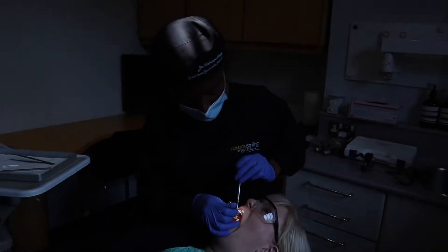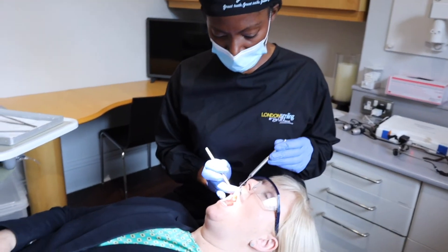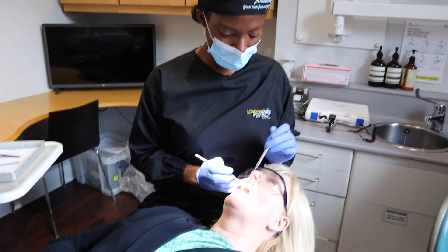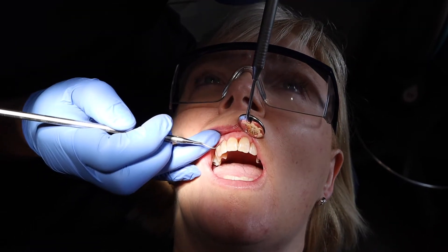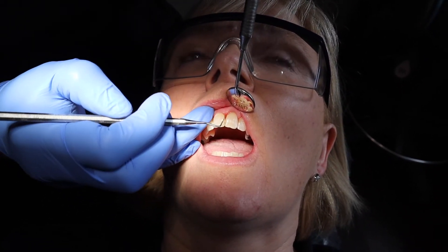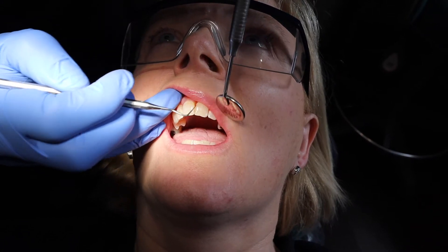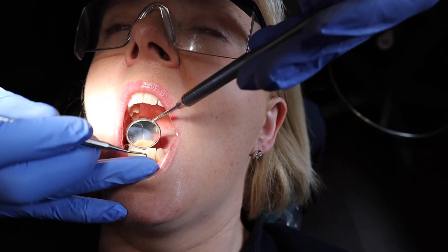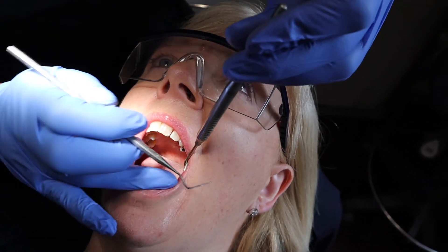So I'm just measuring. The lower the number, the better — ideally we're looking for zeros and ones. Four means that there's gum disease, which hopefully is not the case. Upper right is two, mid three. So you can kind of see from here where the gums are relatively healthy — it's blanching, it's going in, it's not going very far, my little ruler. Whereas when I come here, can you see how it just kind of disappears in under the gum? So here it's three. There's more disease around these front teeth. Upper left is three as well. Lower right is two, mid three. Lower left is two.